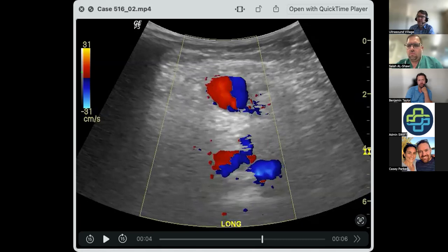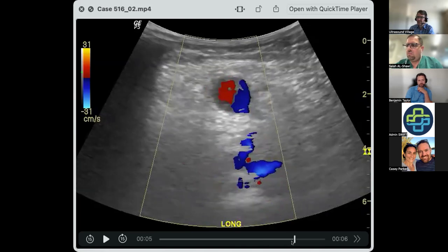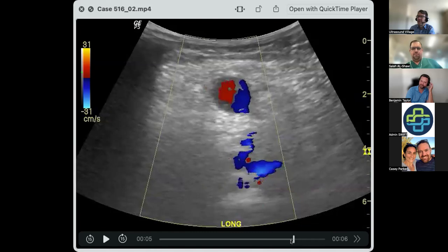The blood will come in and come up and then swirl round. So you get the different colors, and that's called a yin yang sign. It's like a Pepsi Cola. So yes, if you are more of a follower of American culture than Eastern mysticism, you can go for Pepsi. Okay, so that's one thing.